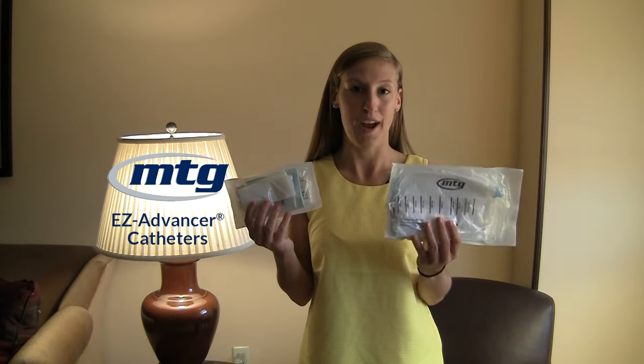Hi everyone. My name's Jamie. I've had a stoma for five years after two failed bladder neck reconstructions. Today I'm going to show you these two products.